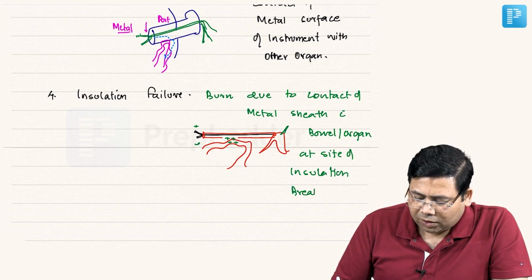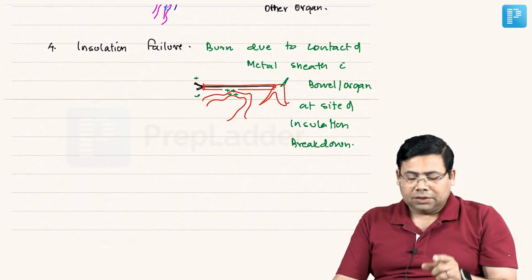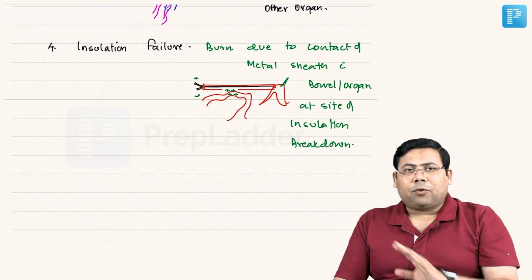Therefore, whenever you are operating on a patient, you should always check well in advance whether the instrument you are using has a proper insulation barrier or not.